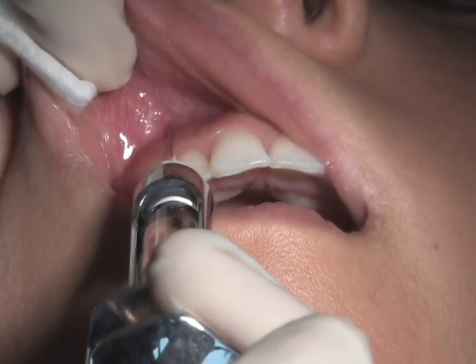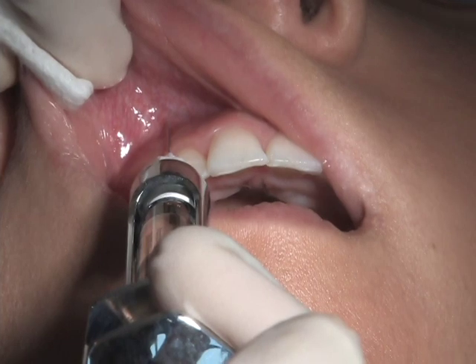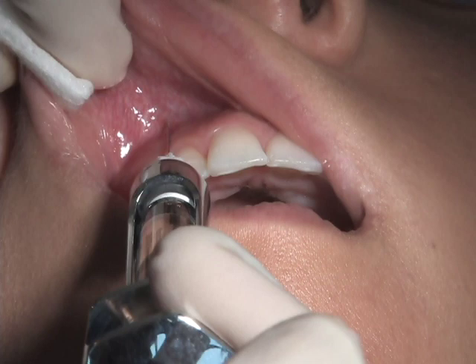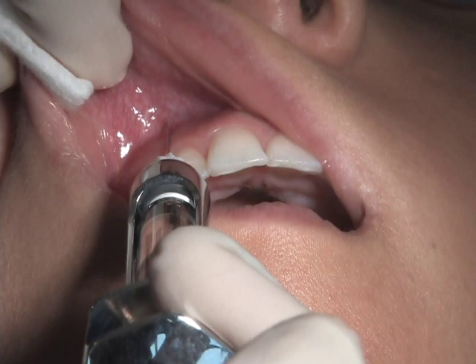Next, advance the needle slowly. This step is critical for administering atraumatic injections. The clinician that advances the needle very quickly is guaranteed to cause discomfort for the patient. Depositing a drop or two of solution in advance of the needle to anesthetize the area on the way to the deposition site is acceptable for increasing patient comfort, but the operator must be careful to use only a slight amount, as the bulk of the solution must be reserved for the nerves to be anesthetized.